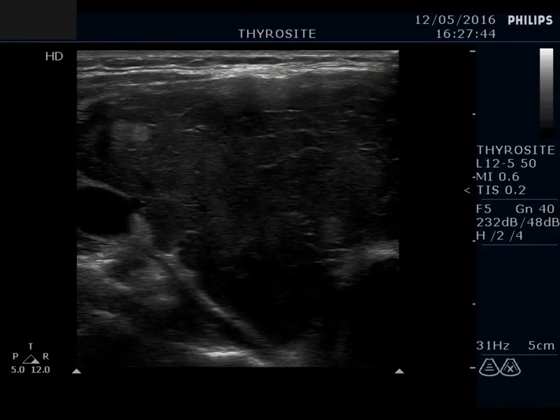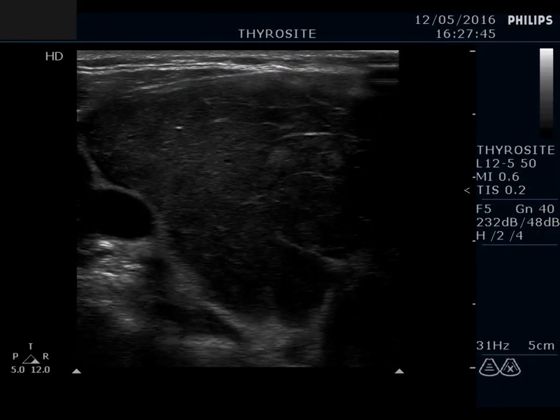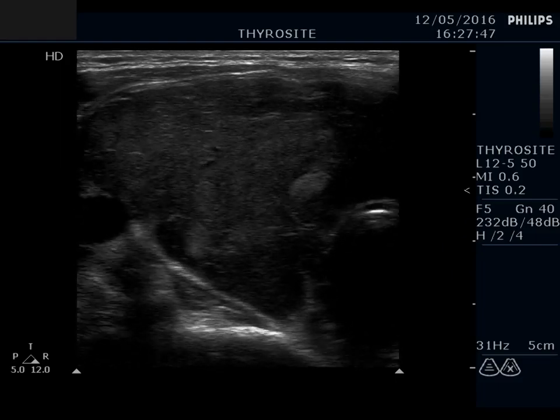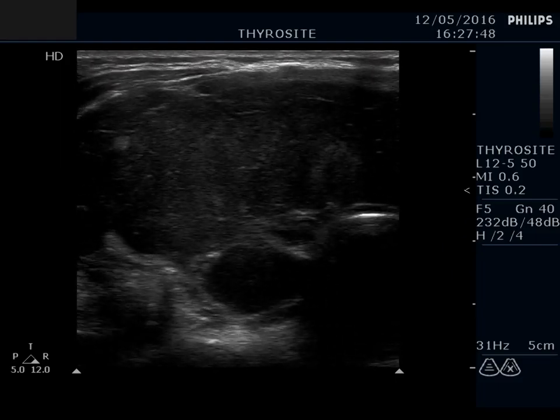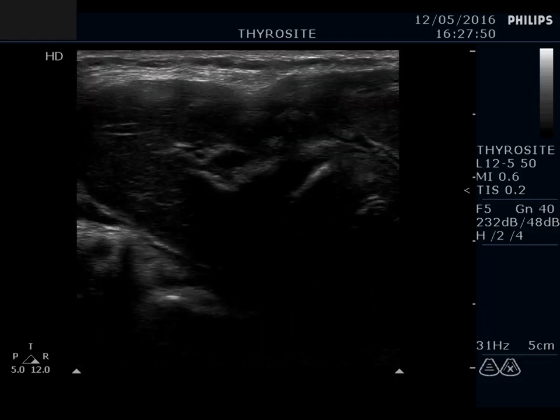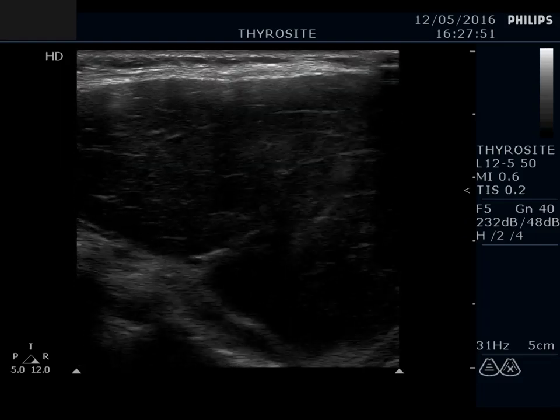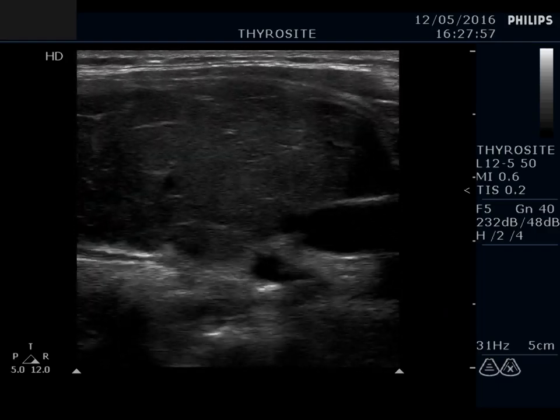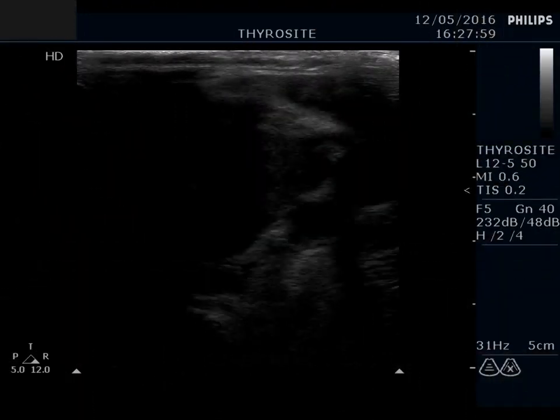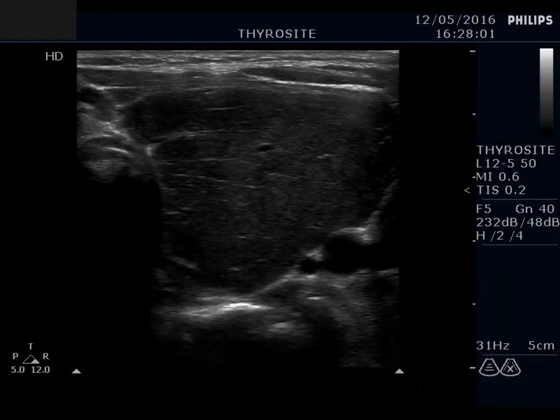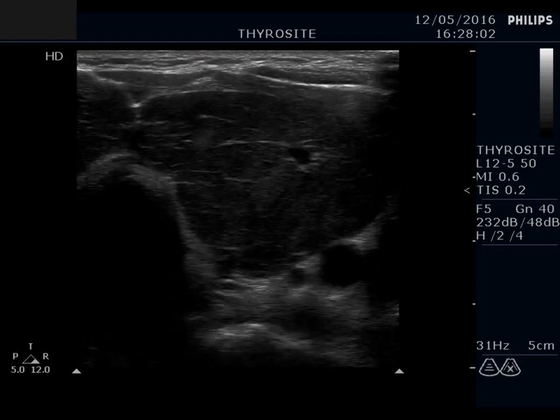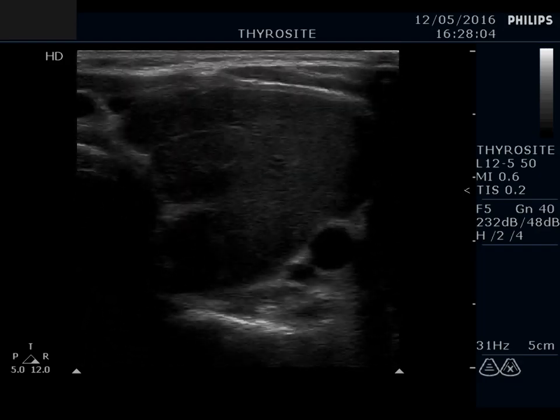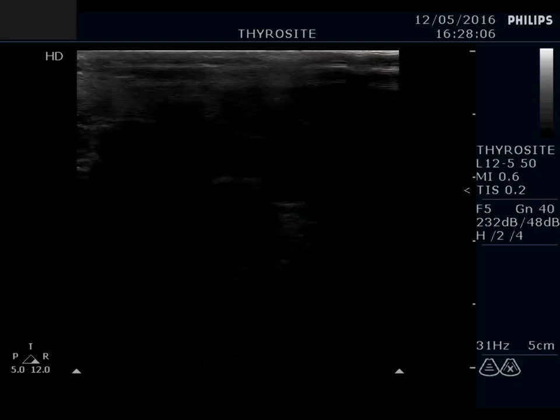The thyroid is enlarged and hypoechoic. There are small echonormal islets which correspond to remnants of the intact thyroid. The discrete, more hypoechoic areas have irregular shape and they are not well demarcated; therefore these lesions do not fit pathological nodules.